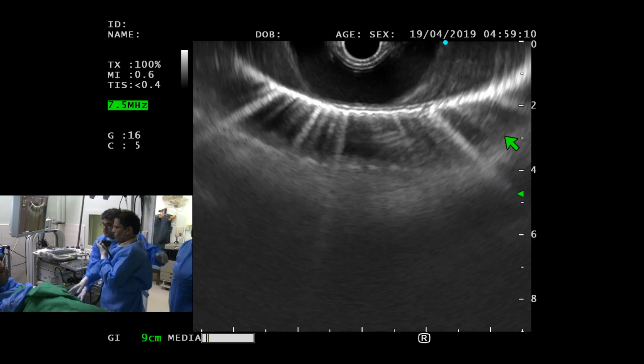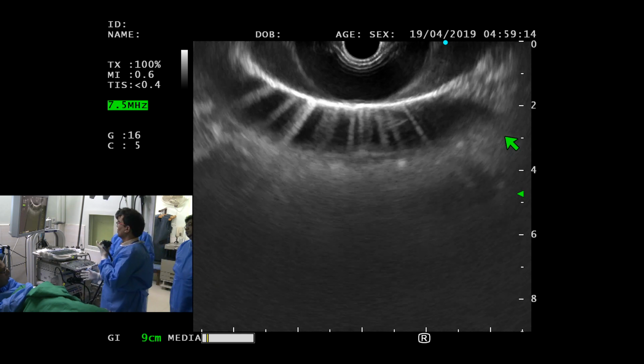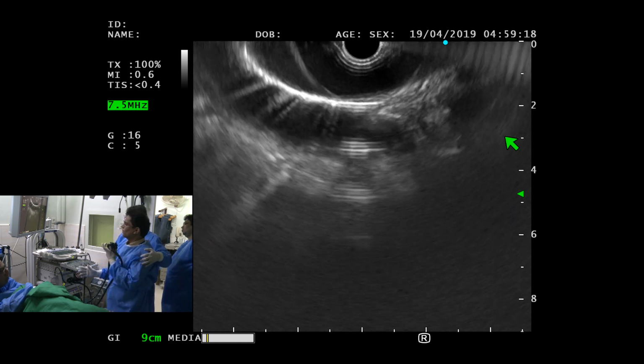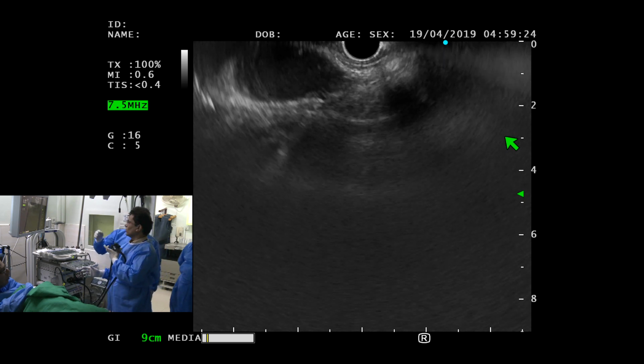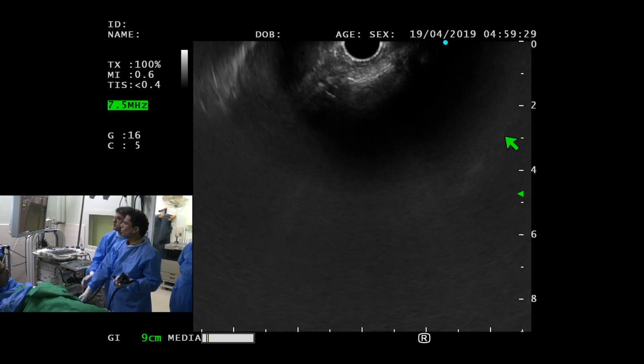So at this point, all you need to do is look at the position that's changed in your case. So you still come back a bit. Give room to the left hand because right and थोड़ा सा भी आप करोगे so then you will see. Go to the left a bit. And you push.